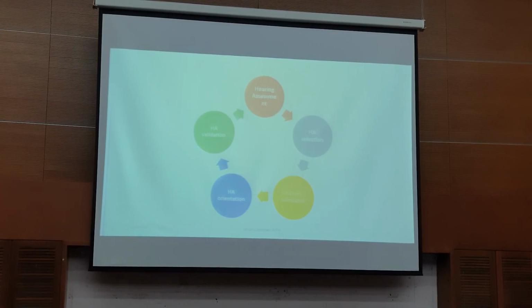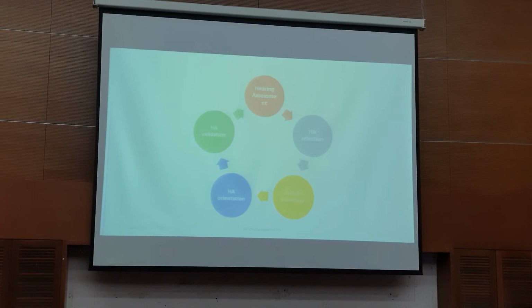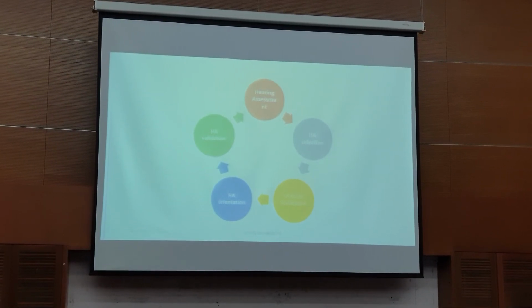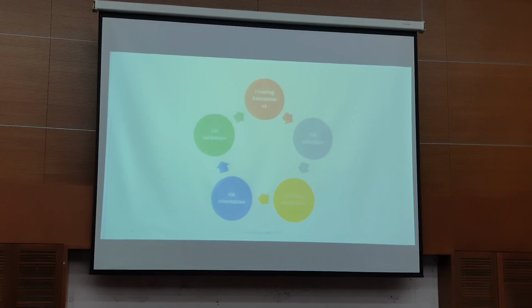We use our prescriptive formula. We can select a few, and then you set the teaching targets. Orientation is when we teach these hearing aid users the components, macam mana nak change battery, bila nak change battery, we teach them kat sini, macam mana penjagaannya dan sebagainya. That's the orientation.